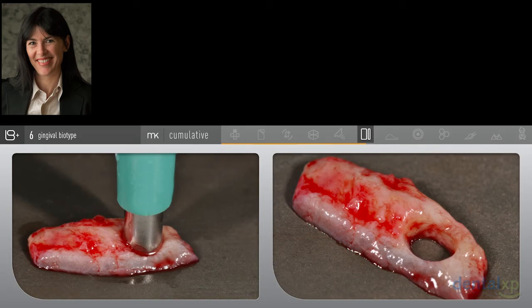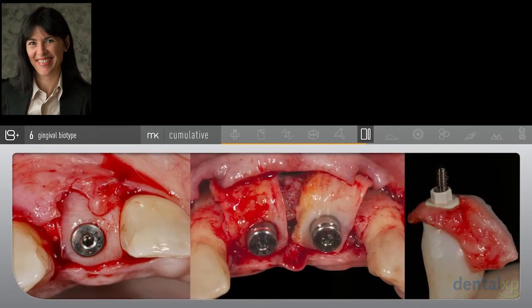When I'm using these kinds of tissues around implants, I have an implant as an ally to help hold it in position. So I do a lot of 3D grafting today around my implants. I graft around healing abutments, and it helps hold my graft in position. I don't always elevate a flap. I'll actually often tunnel and just literally stuff it in there, basically. I'll graft around my provisional restorations.